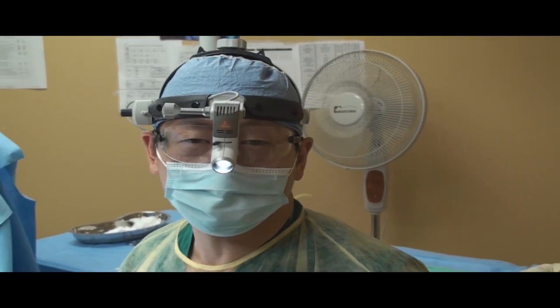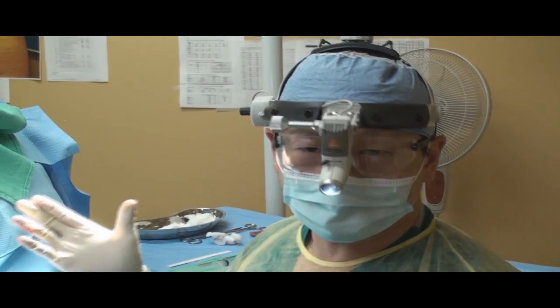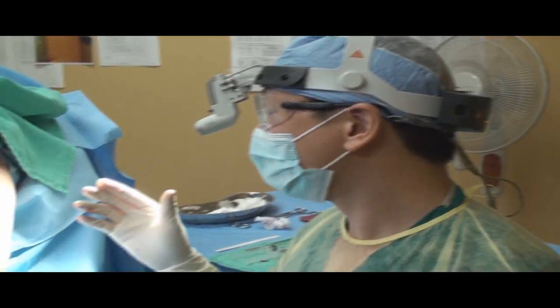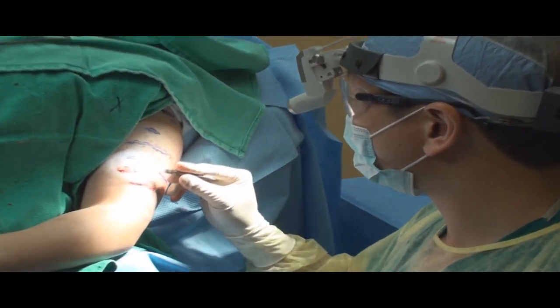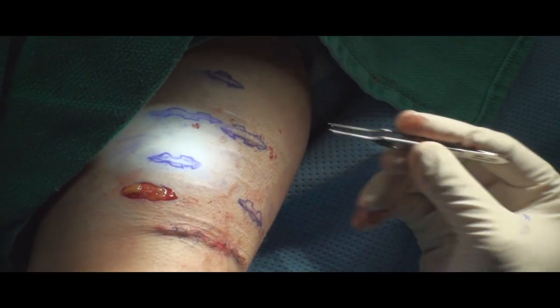Hi, I'm Dr. Young. I'm talking about scar revision today and demonstrating this on a procedure that we're doing today. Essentially what I'd like to show you, if you zoom up here, is these are just a number of scars that we're trying to improve.